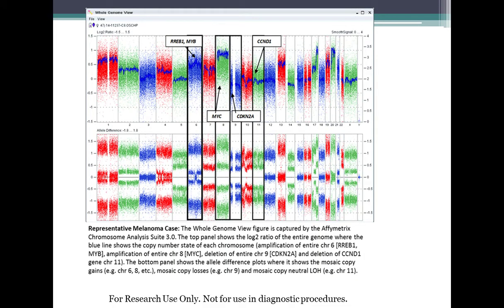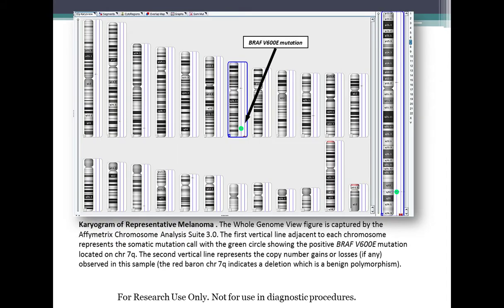Just to give an example of how a whole genome view would look on the OncoScan FFPE assay. This is an example of a melanoma case which shows the gain and loss in the critical genes which are usually abnormal in melanoma.